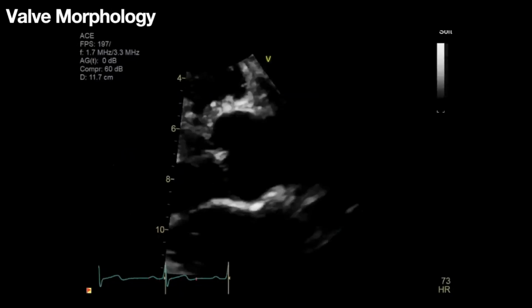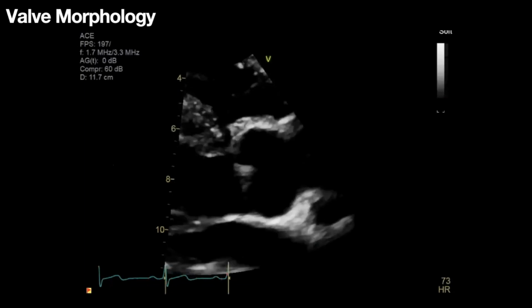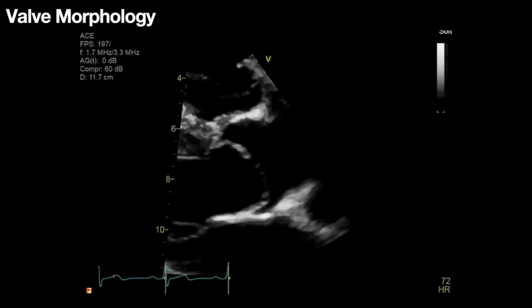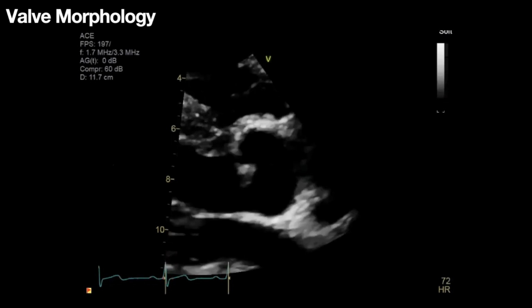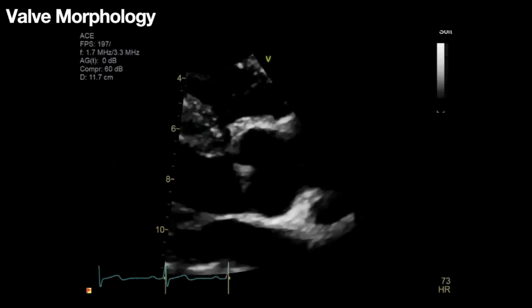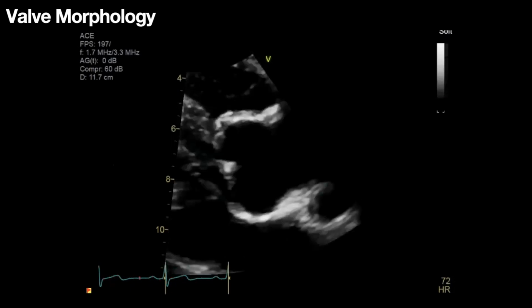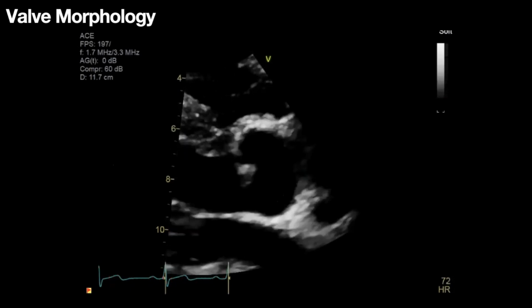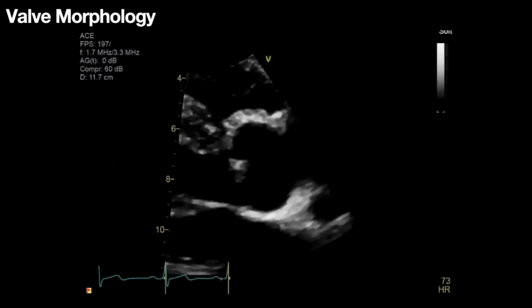What do you think of this one, Foti? This is in the parasternal long, as you know. Yes, so like you mentioned, this is a parasternal long axis. It's very abnormal in its movement. This is a very challenging view, right? Because we don't know if we're just off of the center of the valve and we're looking at one cusp, but there's certainly an asymmetric closure. There appears to be some doming as well of the valves. It doesn't look like it opens up nicely.